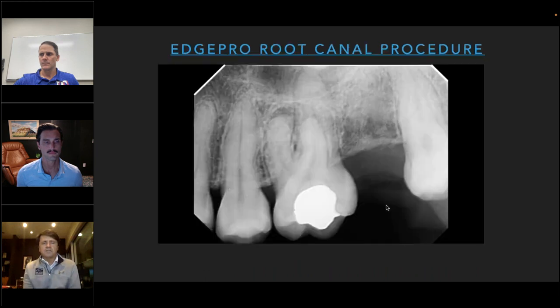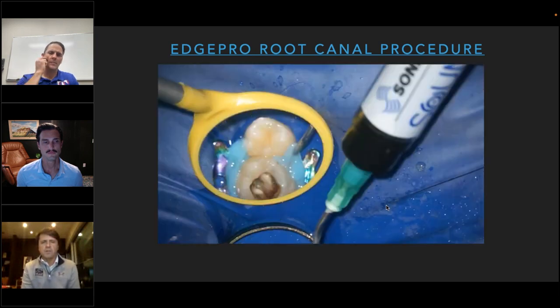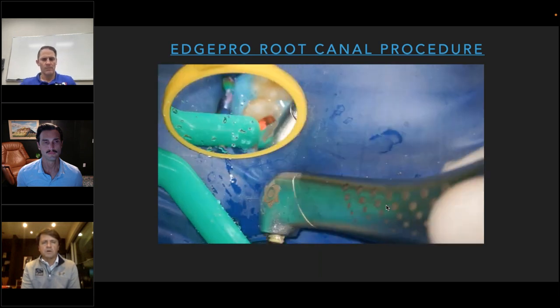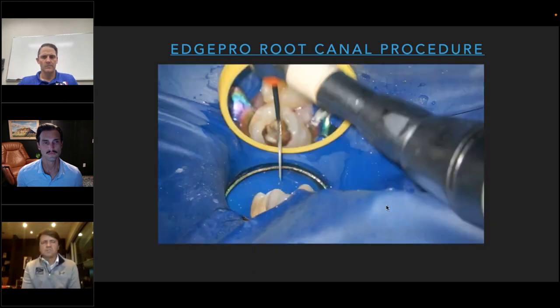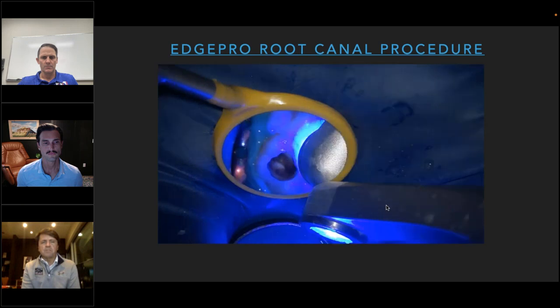This is a case that I did for a lecture I gave to my general dentists in the area about enhanced irrigation. You'll bear with me if you don't mind. Let me real quick, this is doing the chamber mode. Let me see if I can back that up. Sorry. As I mentioned, this is a lecture for my general dentists, so it's going to show the whole root canal sped up because I wanted them to know that this is how it fits into my protocol.